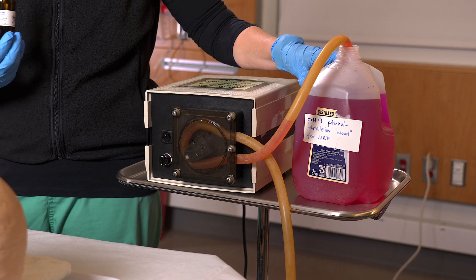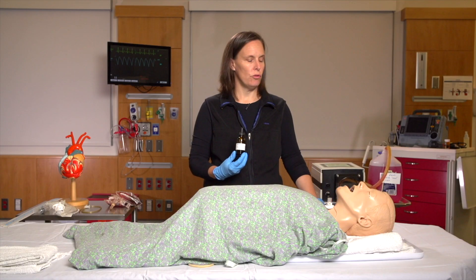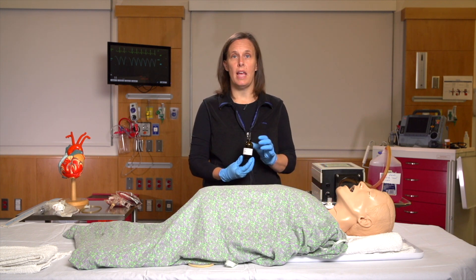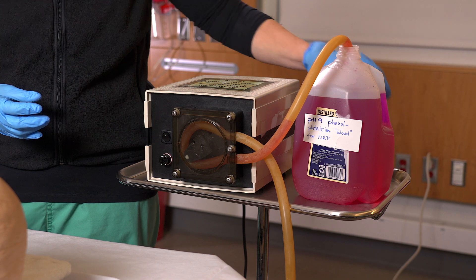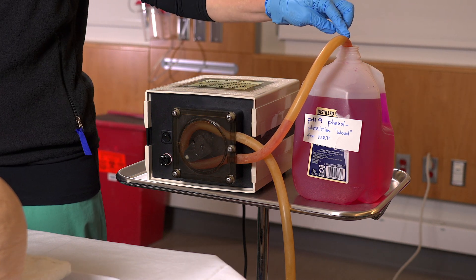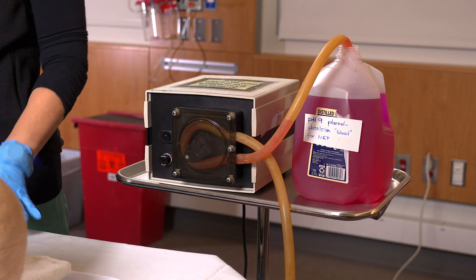The nice thing about this artificial blood is that once it hits your mannequin and your stretcher, it disappears — it turns clear. That way it doesn't permanently stain any of your equipment once the simulation is over. Once you've done that, you're going to connect tubing from your pump into your container of artificial blood, and then also connect tubing from your pump into the mannequin.